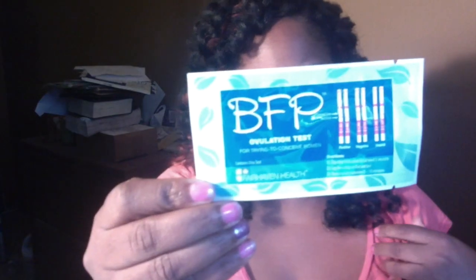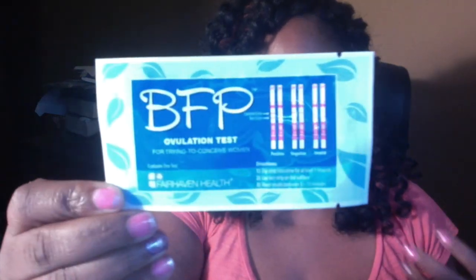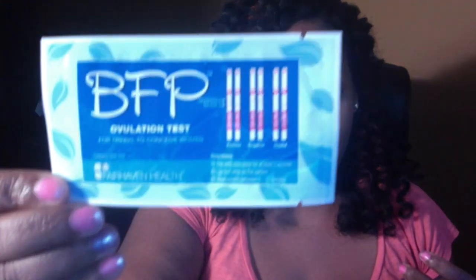There's a bundle that they sell online. It's super cheap. It's probably about 15 bucks for this together. And you get this amount of pregnancy tests and also OPK sticks. So I just wanted to show you what the writing is on these. This is the OPK sticks, and it basically lets you know when it is an actual positive for ovulation. So this is basically used to guesstimate your ovulation.